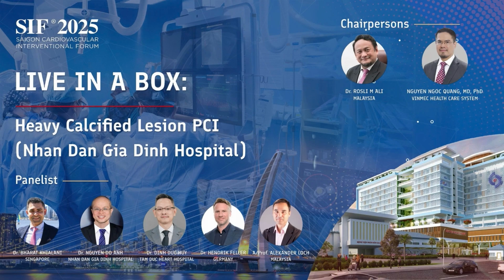Yeah, definitely. I think the left main looks terrible. IVUS can be a useful tool here to guide our procedure. Because of the heavy calcification, I will definitely need some balloon, not a plain balloon, just an NC balloon.